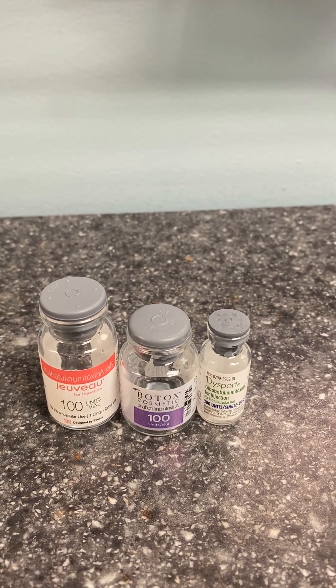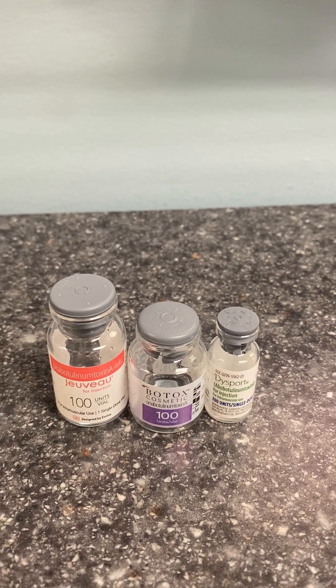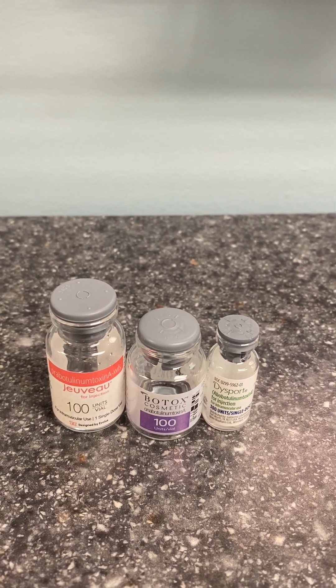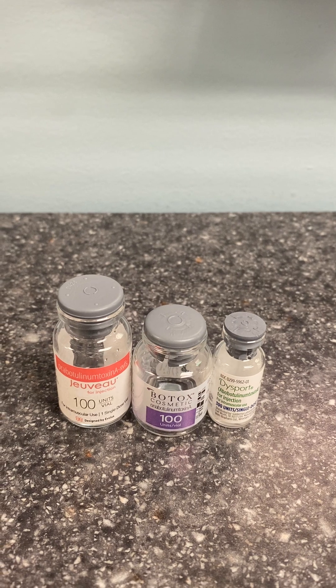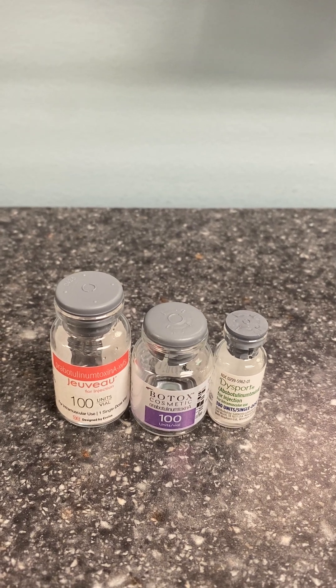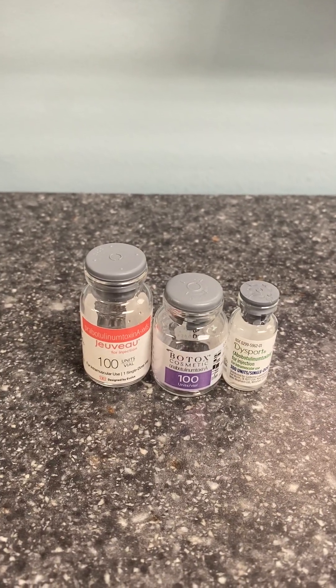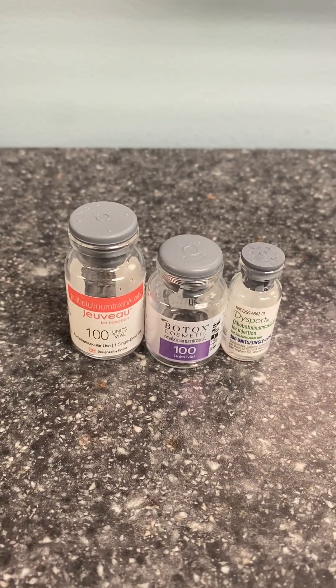We use Dysport all over the place — in the forehead, the crow's feet, cosmetically all over the face — but it is only FDA approved for the glabella. So if you're somebody who worries about that, you'll want to use the other two products for other injection points. Alright, so those are your three products mixed and ready to use.